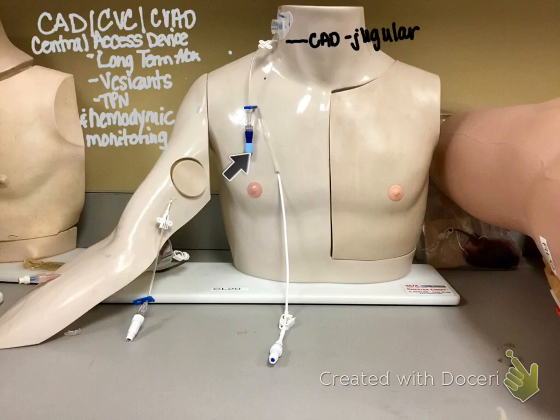And you keep those caps, and you put new caps on when you change, when you do anything. If you flush it, don't put the same cap on. Flush it, put a new cap.